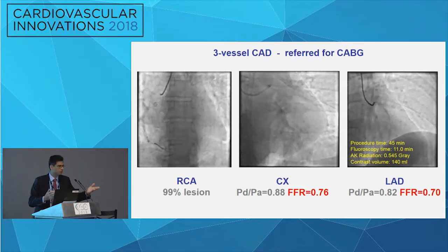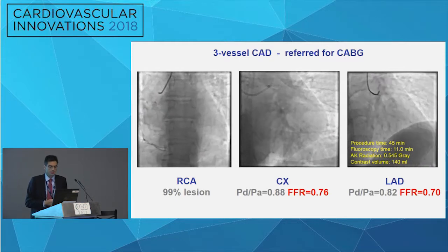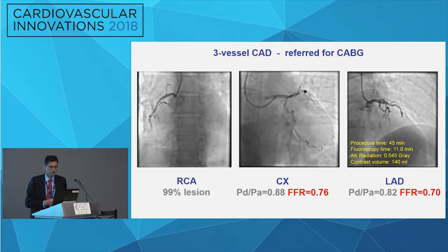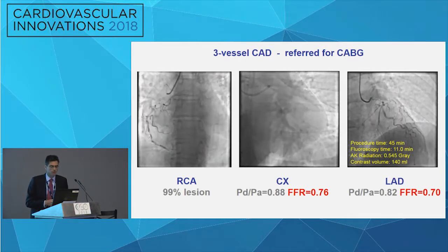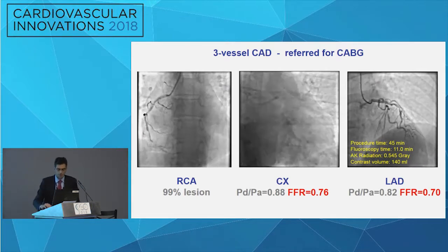I don't know if you guys have seen that, or if you do that. That's, again, two papers you have looked at that. The concern, of course, is that you are intervening. If you don't fix the CTO first, you have more risk. If something goes wrong on the other side, then you have the high risk of the procedure because of the other problems.